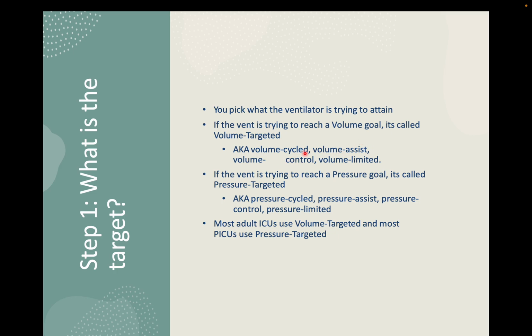So it's volume cycled, it's volume assist, and it's volume limited. Whatever your tidal volume is set to, that is delivered.